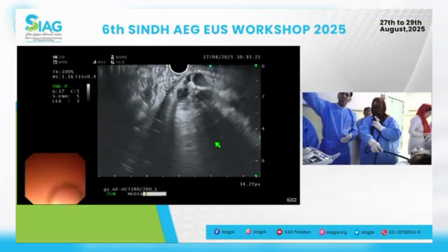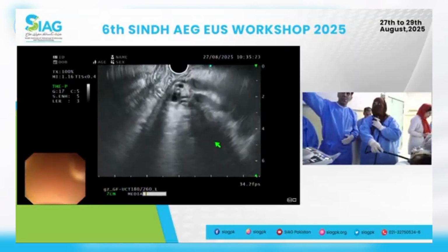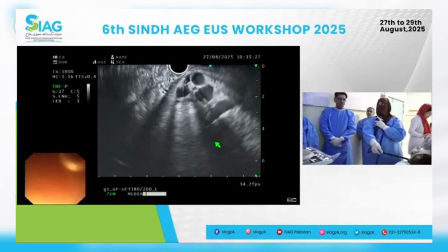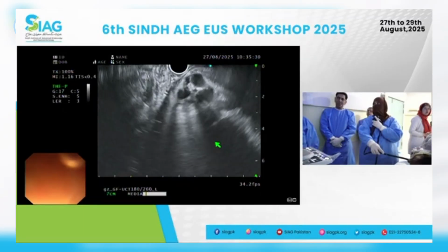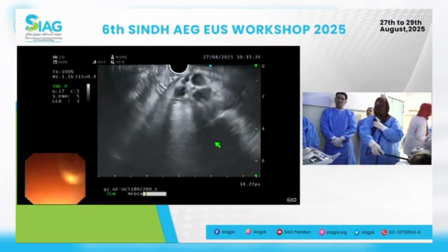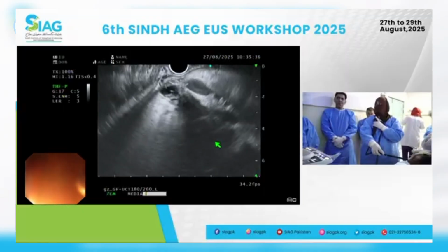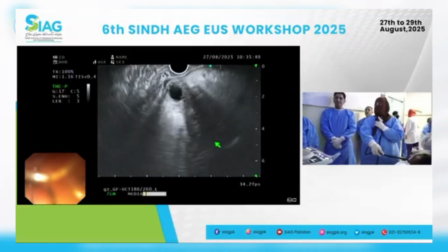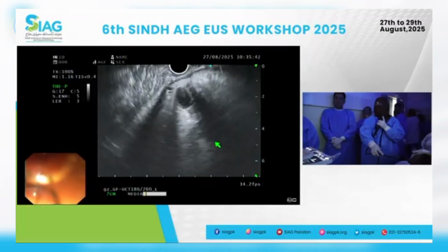Why is there resistance? Why are we actually getting some mucosa hung up against the tip of the scope? But we didn't see anything, we didn't appreciate anything, did we?